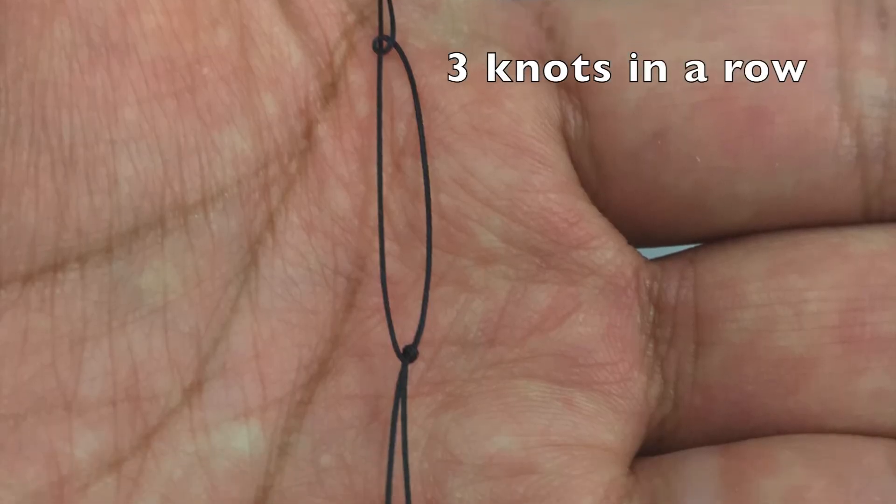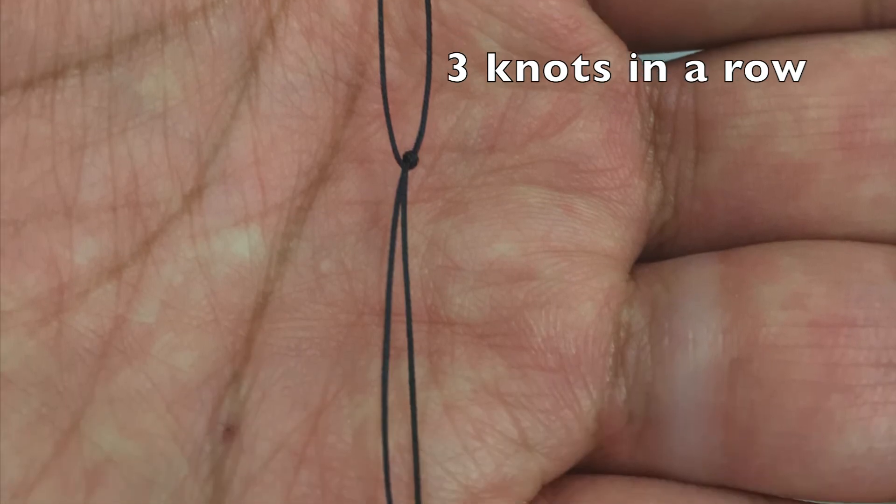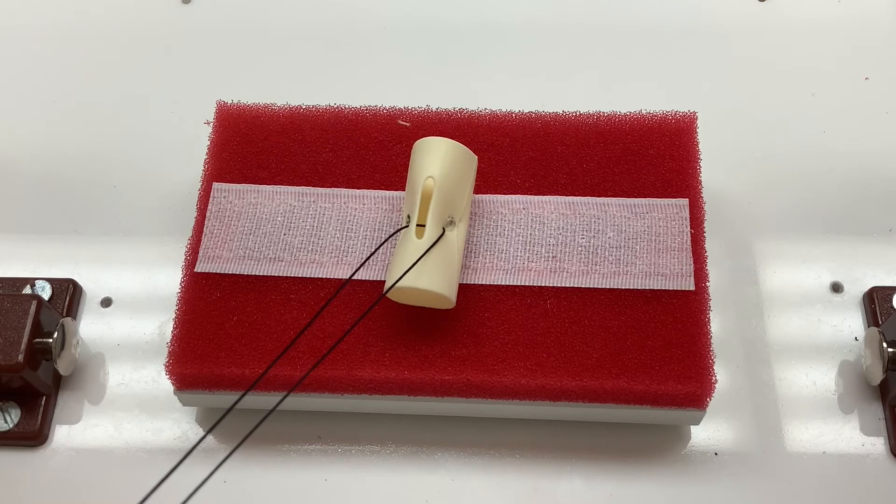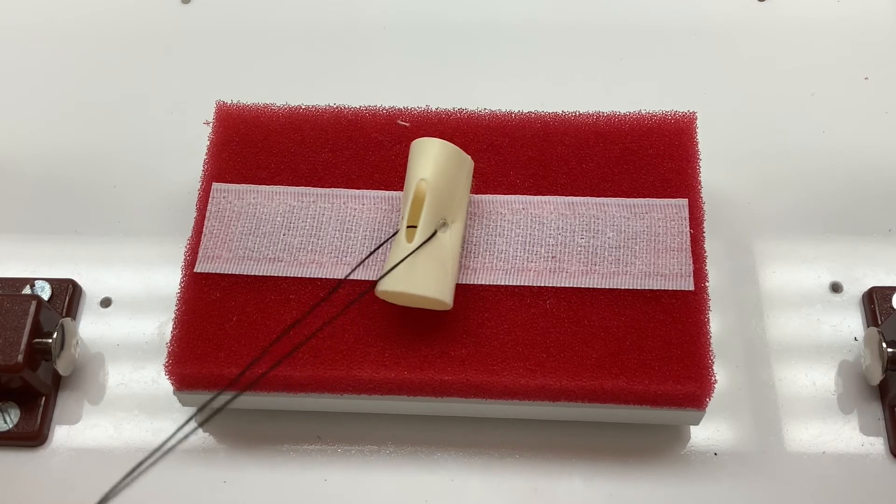We tie 3 square knots in a row as shown. This allows the examinee to rapidly push down the knots in succession.